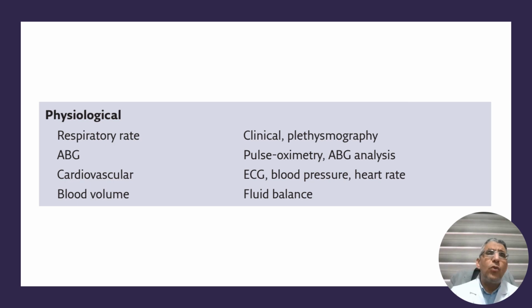Arterial blood gases: there is no need for arterial blood gases except after 2 hours of the start of NIV. However, there is continuous pulse oximetry, so you have the saturation in front of you, and if there is capnography, you have end-tidal carbon dioxide continuously. So you do not need invasive monitoring by arterial blood gases except after 2 hours of the start of NIV, or if the patient is not responding within 1 hour, then you have to do arterial blood gases immediately. These are the choices. Also, ECG: there is continuous 24-hour ECG monitoring on the screen above. Also, the heart rate and the fluid balance are very important.